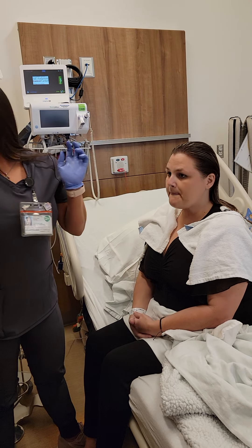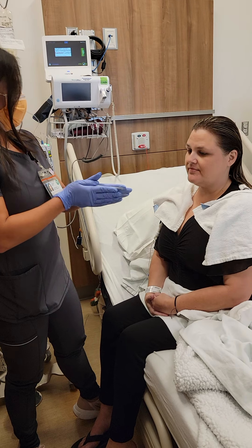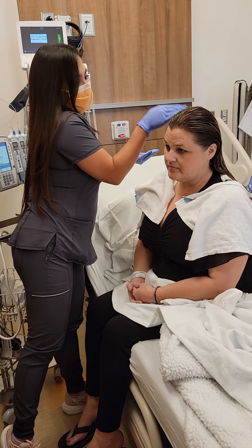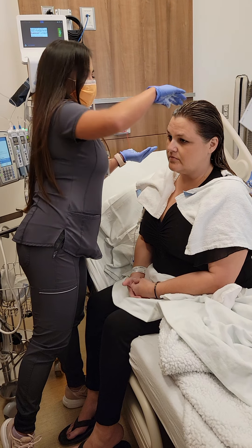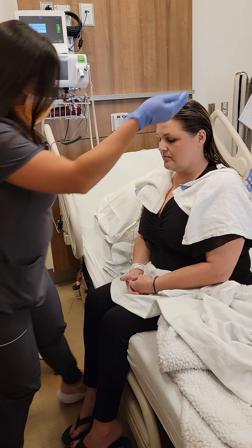Now we just put on the conditioner — Paxman conditioner. She's probably going to go through this since it's like 12 cycles. We also have other patients that use other conditioner, as long as it's free of sulfate and perfumes and all that bad stuff. You don't want it.